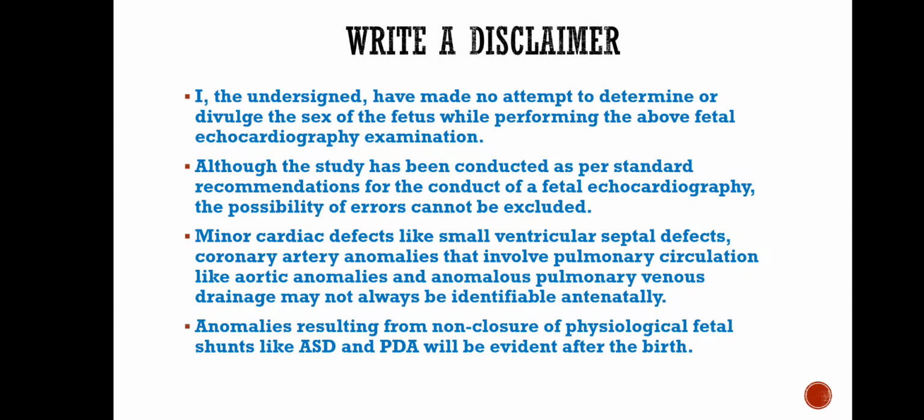Even when a fetal echocardiographic examination is performed according to recommended standards, certain lesions may remain undetectable prenatally. Small ventricular septal defects, coronary anomalies, some aortic arch abnormalities, and anomalous pulmonary venous drainage may not always be identified before birth. Therefore, a clear disclaimer should always accompany the report.